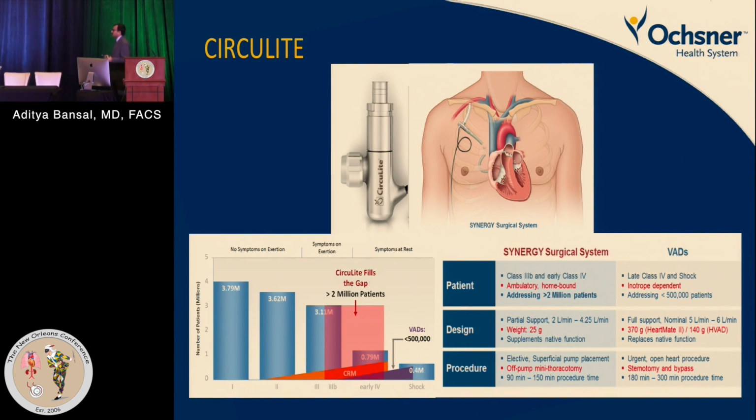CIRCULITE is another platform that had been acquired by HeartWare. Now I think HeartWare was acquired by Medtronic. So that platform, if you look at it, is almost the size of a AA battery. Significant improvement in size. They're still working on cannulas, because I think the cannula technology has lagged behind compared to the technology in the MCS world.